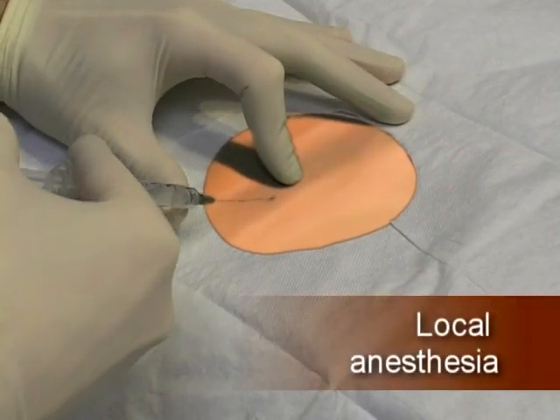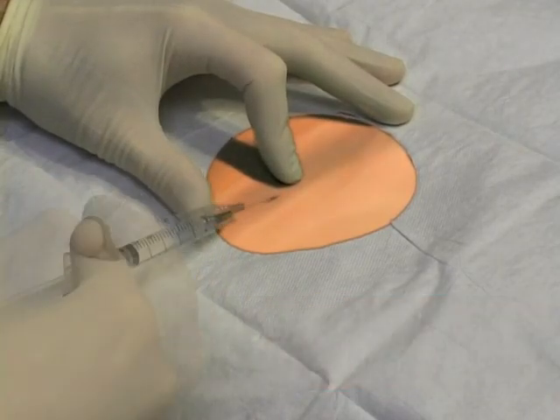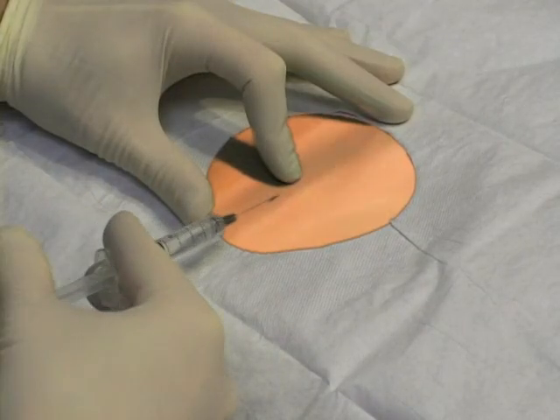Inject local anesthetic along the planned trajectory of the catheter insertion, notably anesthetizing the periosteum of the clavicle to avoid pain as the insertion needle passes underneath the clavicle.